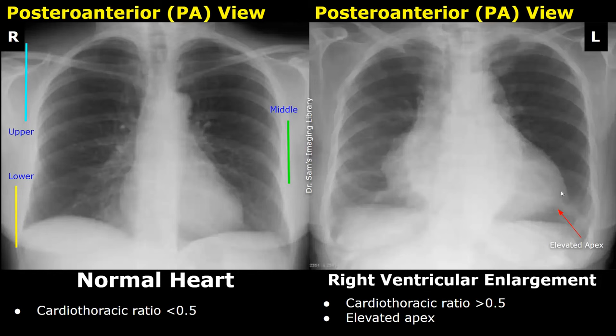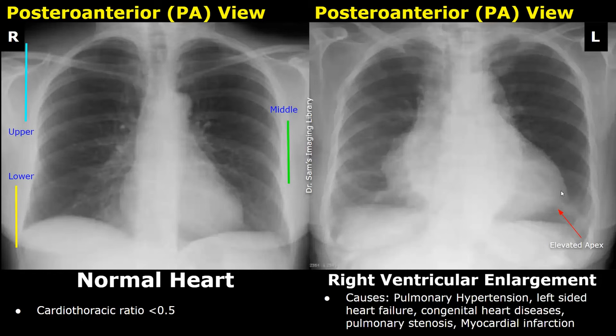Causes of right ventricular enlargement include pulmonary hypertension, left-sided heart failure, congenital heart disease, pulmonary stenosis, and myocardial infarction.